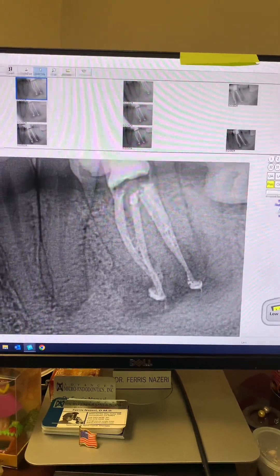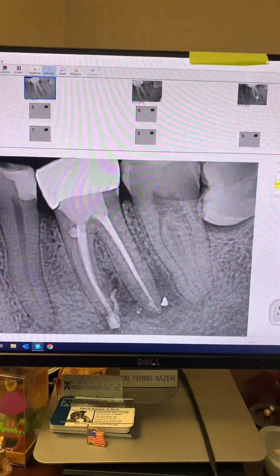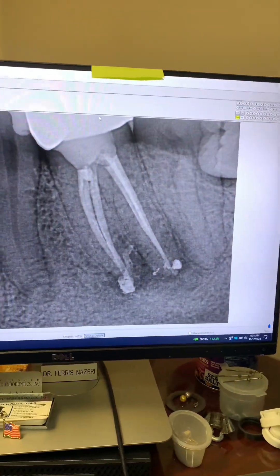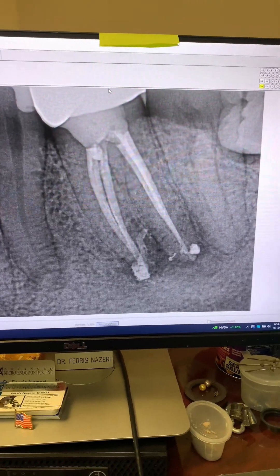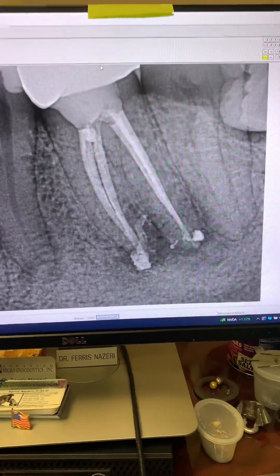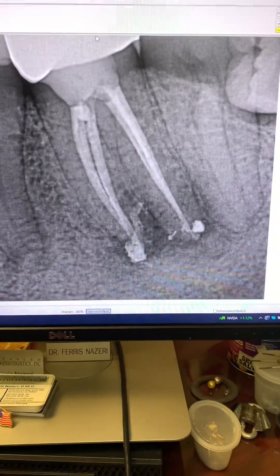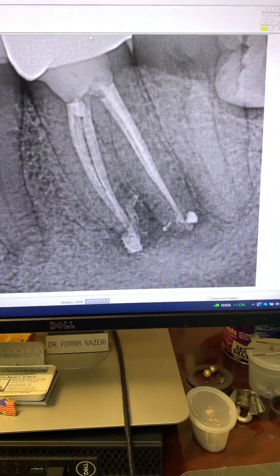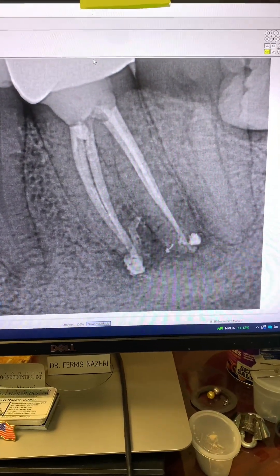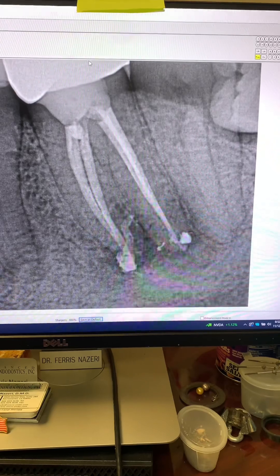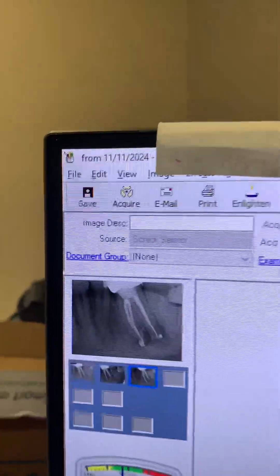Let's take a look at the six-month post-op. The tooth now has a crown on it. The patient has zero symptoms. The buccal sinus tract is completely gone. The tooth is in full function with no symptoms whatsoever — the patient is extremely happy. Look at this beautiful healing in only six months. Remember that huge periapical lucency we started with? Look how much smaller it has gotten. The inflammatory resorption has stopped — no more of the tooth is being destroyed — and the periapical lucency is much, much smaller.